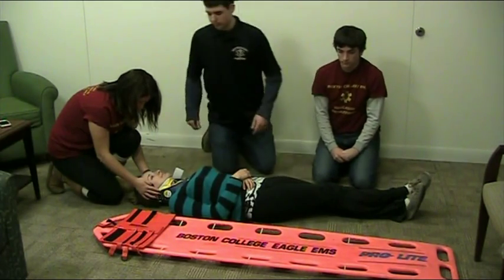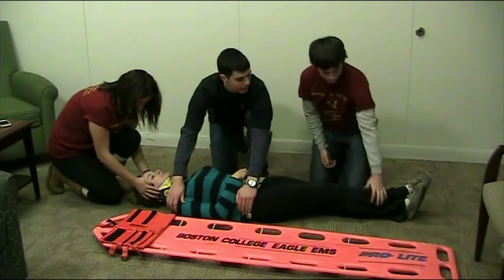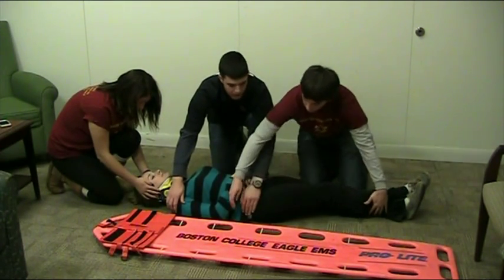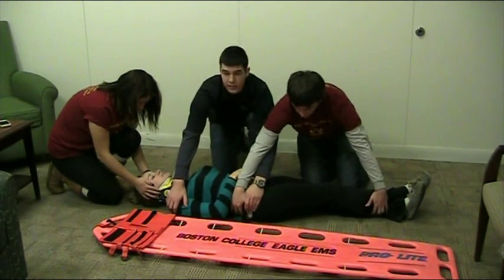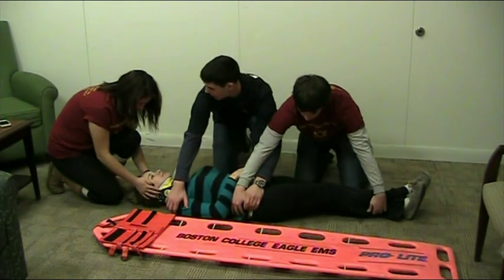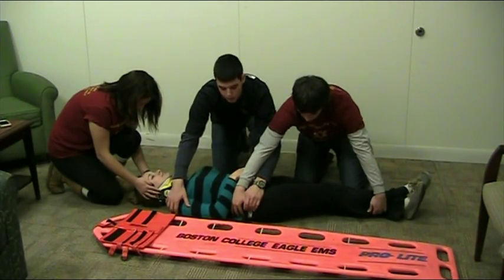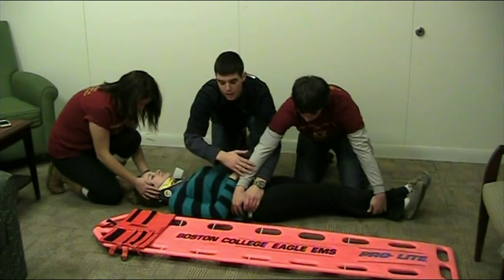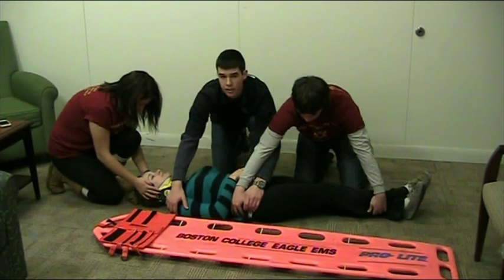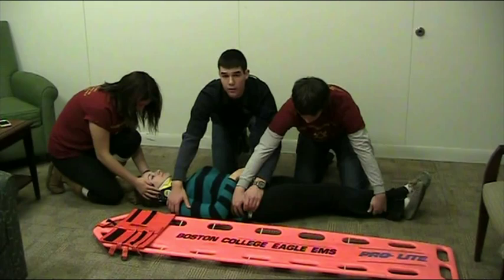To properly log-roll, one partner puts their hand at the shoulder and the other hand at the hip, and the other partner puts one hand down at the leg and crosses over at the hip to get better leverage. On the head's count, we will roll the patient towards us, and then Kevin will grab the backboard with the hand that's on the hip and bring it towards Kayla's back. I will also check the spine to make sure that there are no other deformities. Kristen, on your count.